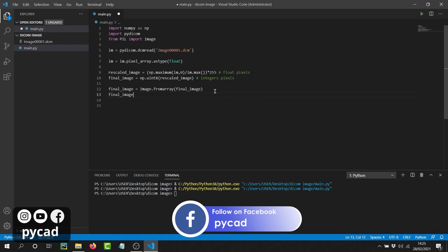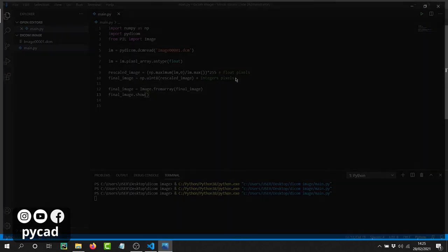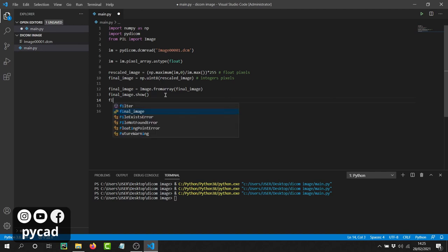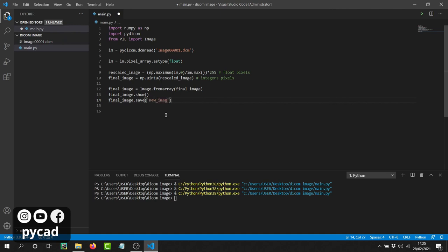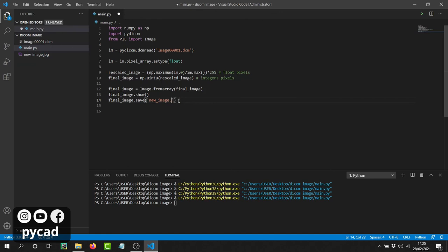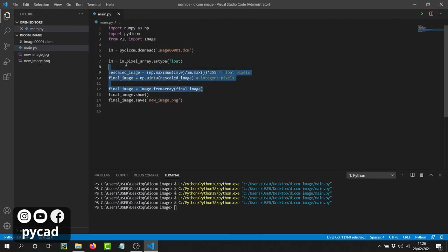Now the image is ready. If we want to display it, we just call `final_image.show()`. To save it as JPEG or PNG, we call `final_image.save()` and write the filename — for example, `new_image.jpeg`. You'll see the JPEG file appear in the project folder. You can also save it as PNG by writing `new_image.png`. After doing all this work, you can save it as any format you want.